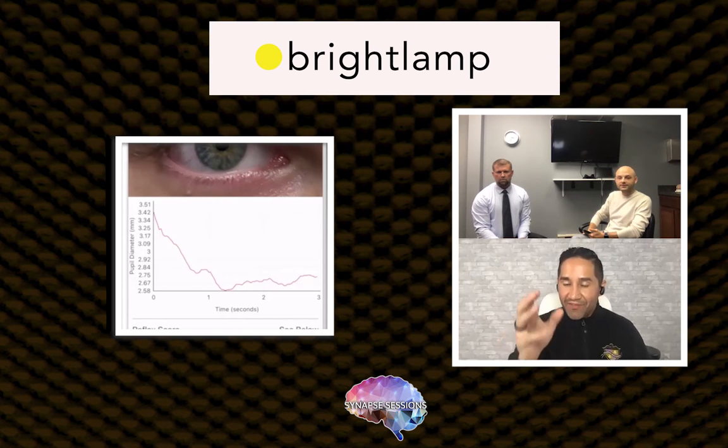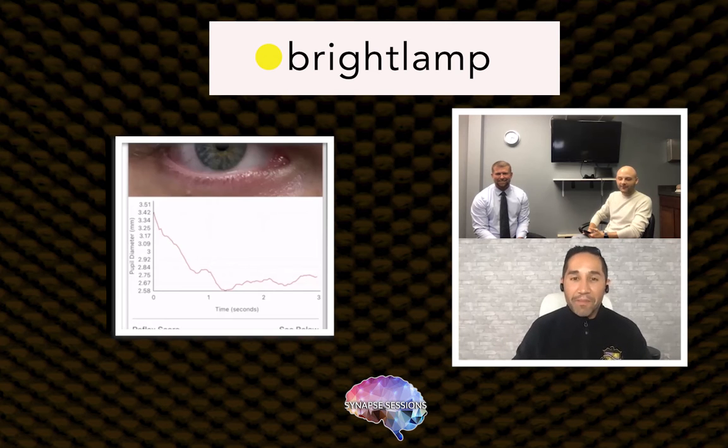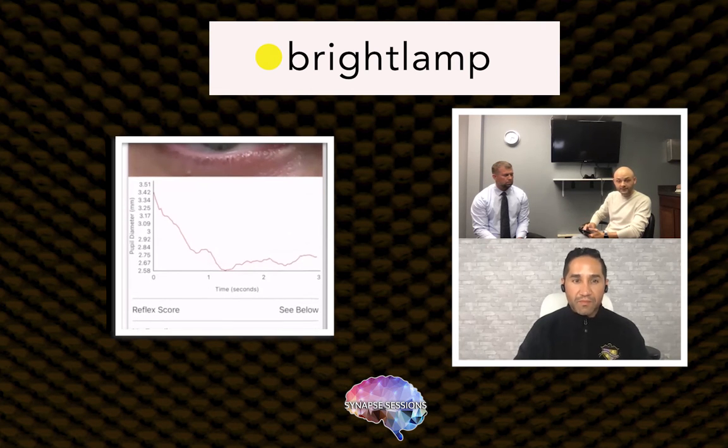Okay, and I'm assuming, and I can't see it from the side, it's using the, I have my phone right here. It's using the little flash there to give the light stimulus, right? Yeah. Which has got to be terribly convenient considering the camera and the flash are literally right next to each other in the latest iPhone design. The latest iPhone just came out, so I hope the design still works. I believe it does. So it's shining the light, right? So you see the reflex, and at that point, the camera is gathering all that information, right? Yeah, it captures the video while the flash is enabled, and you can see here that the video is being acquired, and it processes the data and displays it to the user.